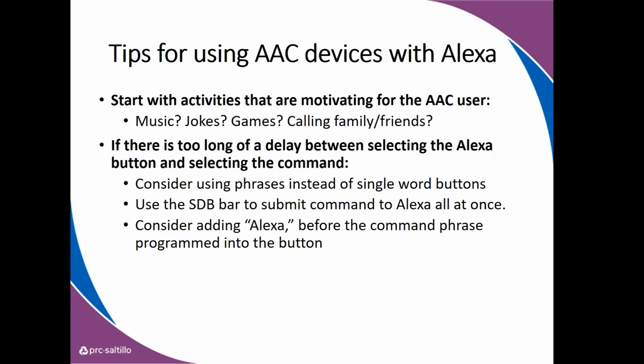So if it takes a little longer to build the words for that command, you still can repeat the full sentence to Alexa. Because Alexa, it seems like she has about a 15-second wait, and then she gives up on you, right? But it doesn't have to be, because you can repeat it in the SDB bar. Or you can put the whole phrase in a button to make it easier.